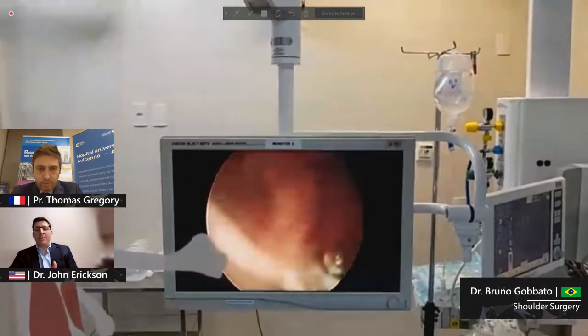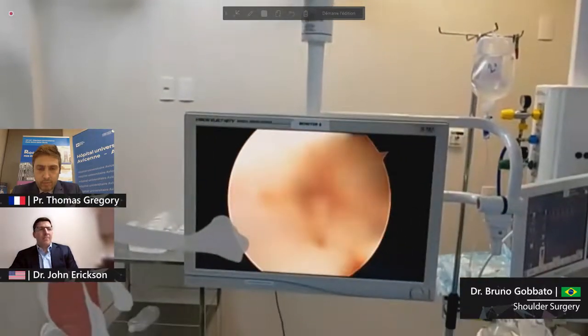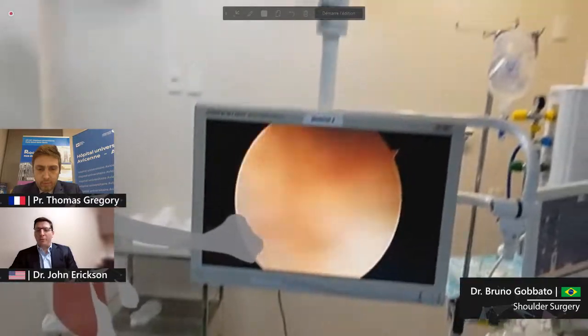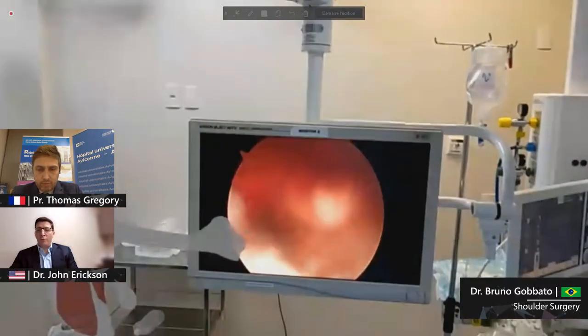may seem somewhat expensive, but in comparison to, say, a robot or other high capital expenditure things that hospitals often are not interested in, or that are a very difficult selling point, this is something that is useful for so many things.